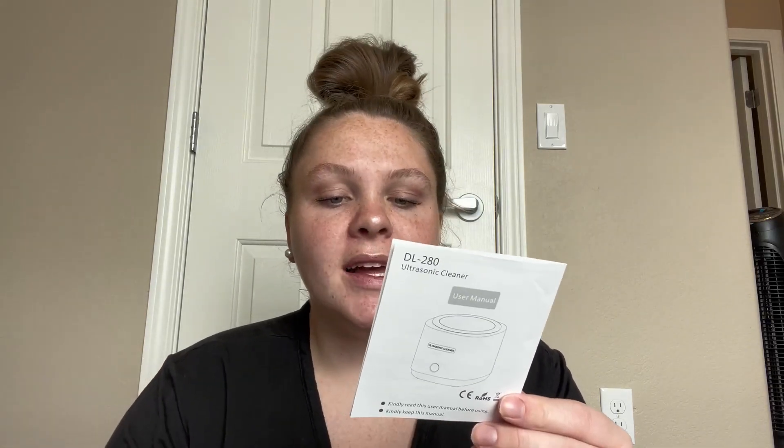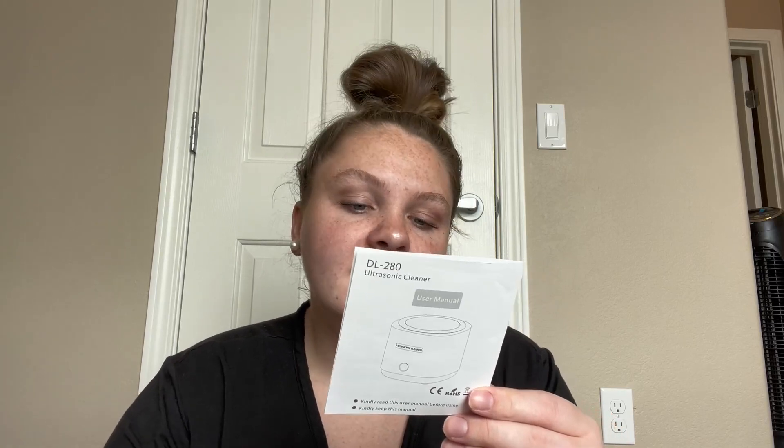When cleaning is finished, unplug it and open the lid, take out the items, pour the water from the stainless steel tank, and wipe it up. So it's super simple, and I'll go ahead and show you how to do it.